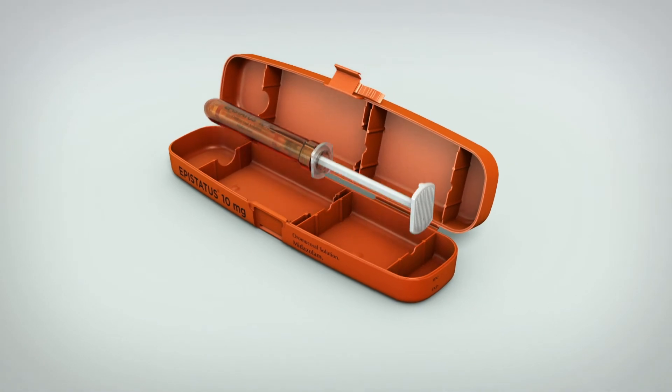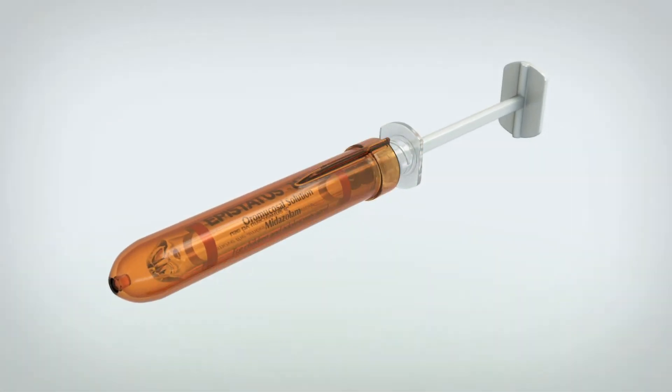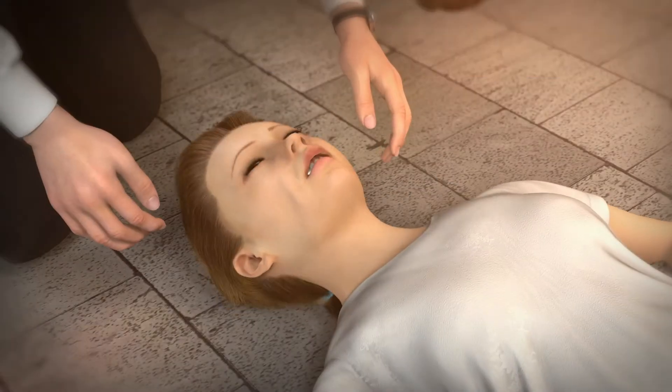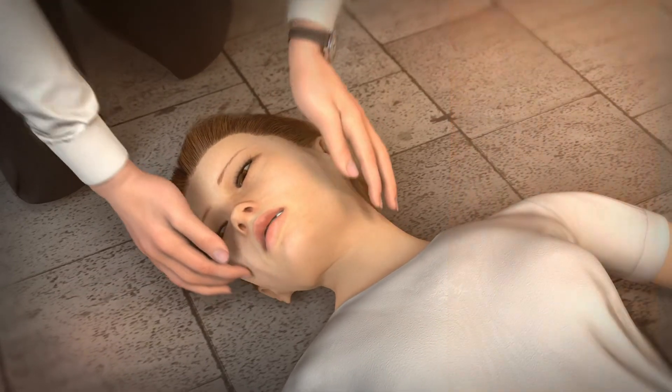Remove the syringe from its outer case. If the patient is not already on the floor, you do not need to place them there. Gently turn their head to one side.